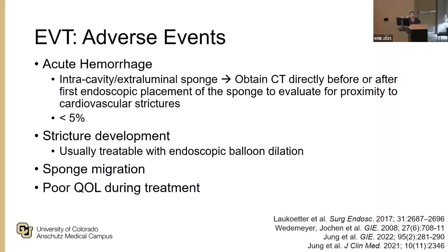And then something that hasn't really been described well in the literature, but definitely needs further evaluation, is that a lot of our patients have pretty poor quality of life during EVT therapy. They can't have anything by mouth. Their mouths are constantly dry. They have something sticking out of their nose. And I think this is just something important for us to recognize before we recommend EVT therapy to patients, and something to discuss with them as you're consenting patients to embark on this therapy.